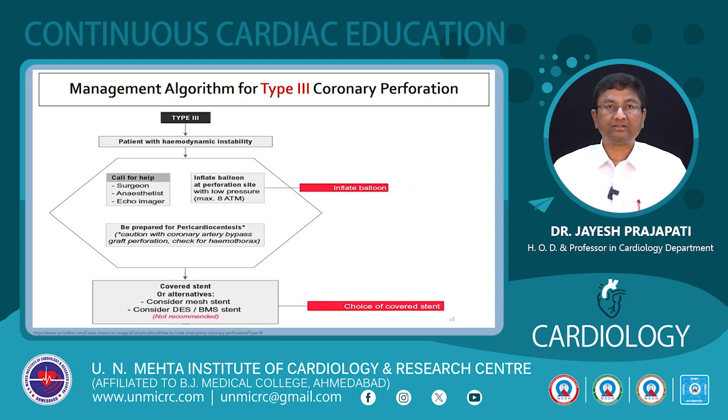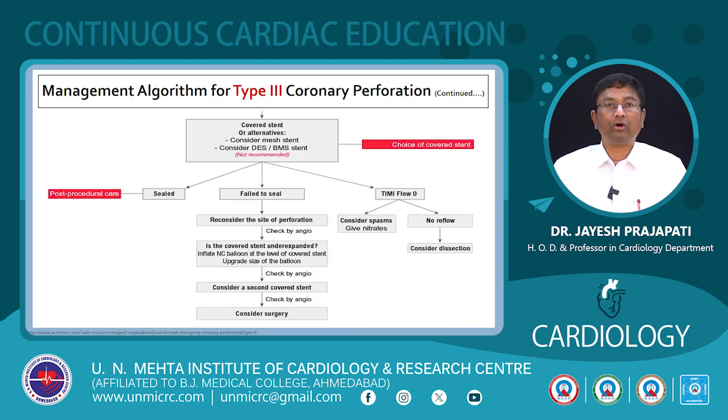Regarding the reversal of the heparin with protamine, we have to check the ACT, but don't reverse too much because it can lead to proximal thrombosis and the patient can die of ischemia because of thrombus. In between, you have to check whether the perforation is sealed or there is free flow. If there is hemodynamic instability, give IV fluid first, make the resuscitation, put a pigtail inside the pericardial cavity, aspirate it, do an autotransfusion. So that is a remedy.